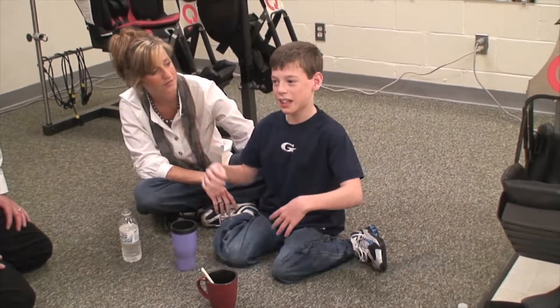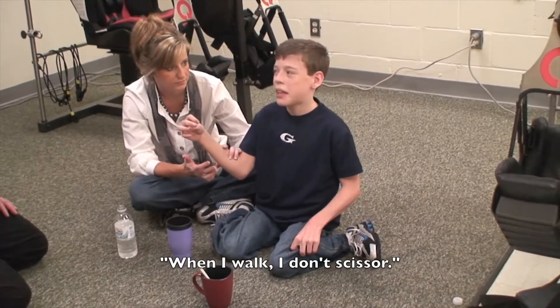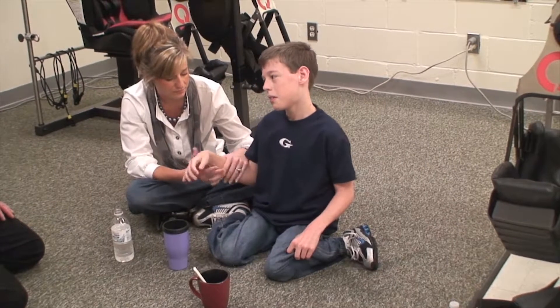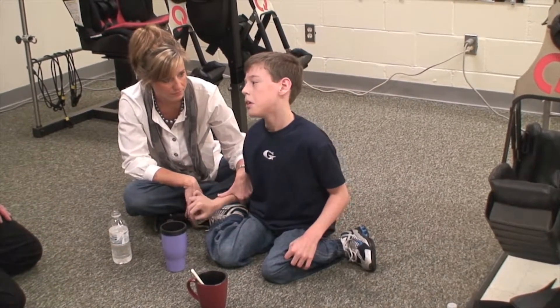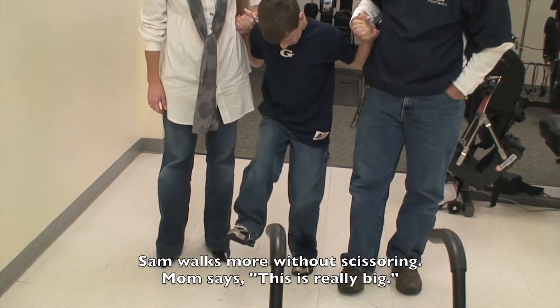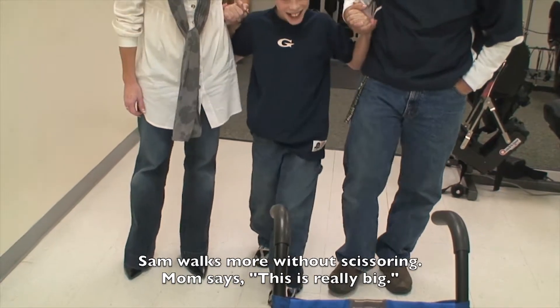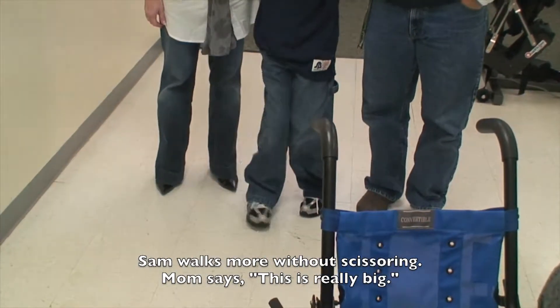So it feels good? Yes. Like when I walk, I don't scissor. You're not scissoring — your feet are straight, Sam. They are. Look at the smile on his face. That is awesome, Sam. Scissoring is a big piece. Yeah, that's the first thing.